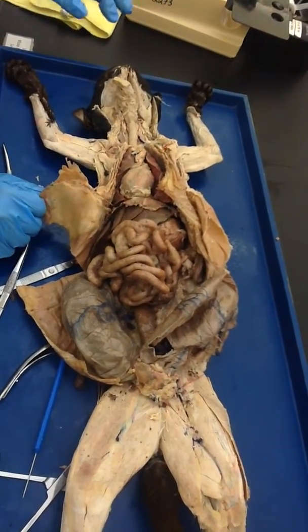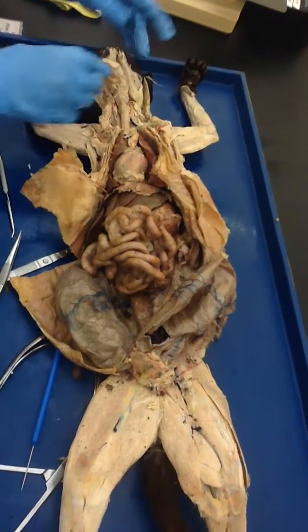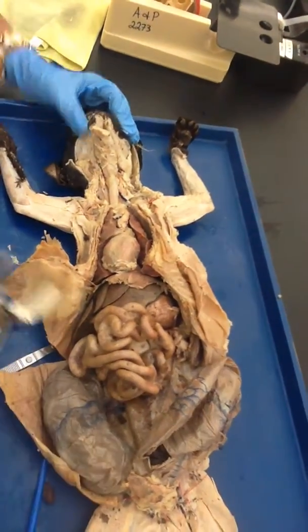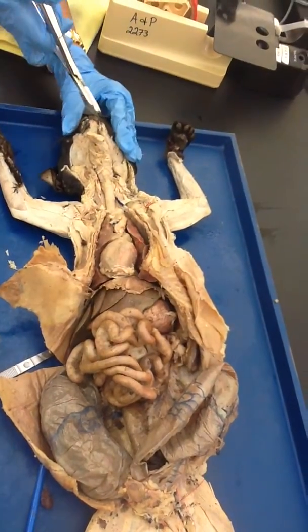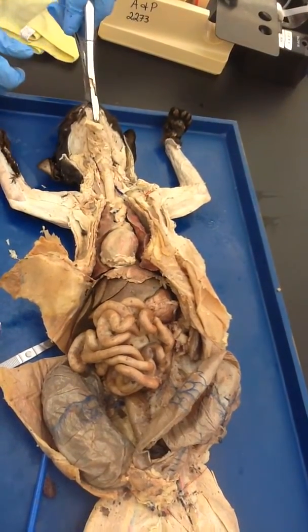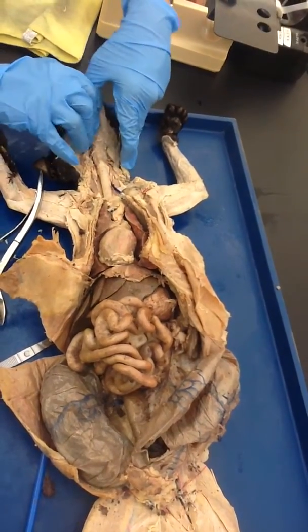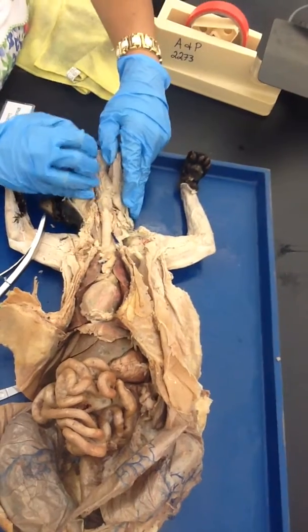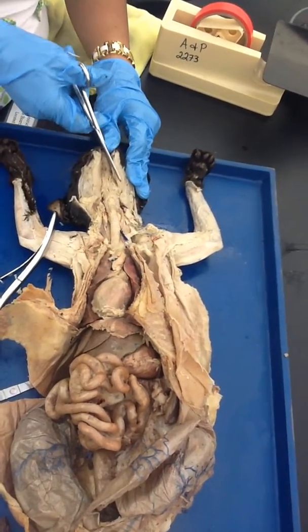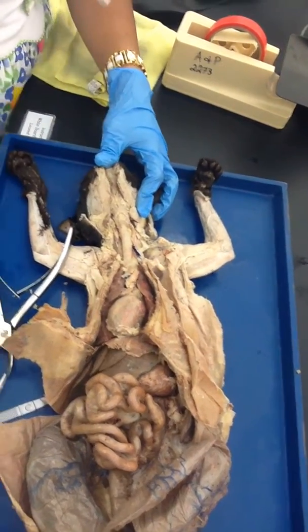Today we are going to do internal organs. In order to do the internal organs, we are going to first cut the lower jaw of the cat. You are going to use a bone cutter and cut it in between here, and once you do that, you are going to pull this apart. While you do that, you are going to cut with scissors on the side next to the digastric, and separate it out.